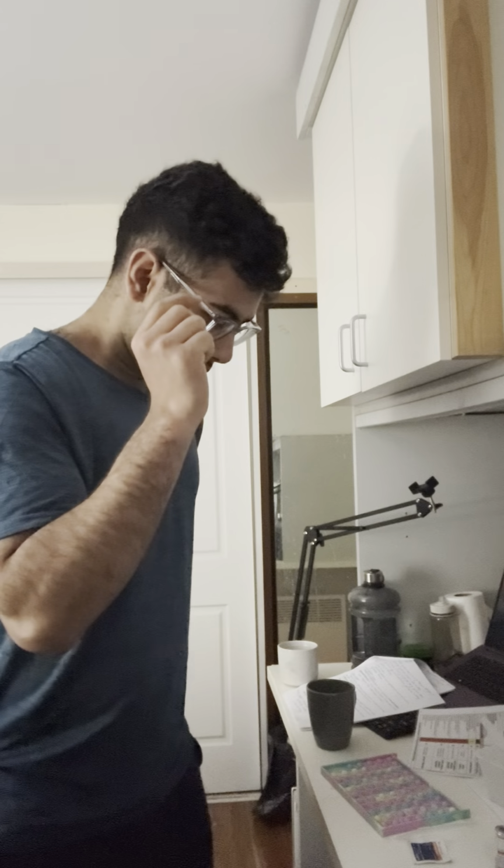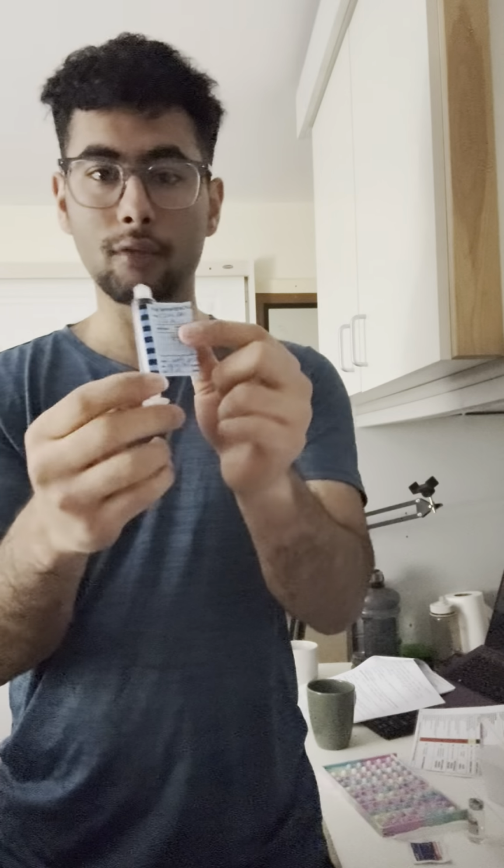Cool. This is a saline as well. I don't have the label for now, but this is a saline as well. This is a post flush, right? Cool. Now we're gonna make the bolus, which contains the antibiotics, right? So for this one, there is always a labeling, and you have to write it down.